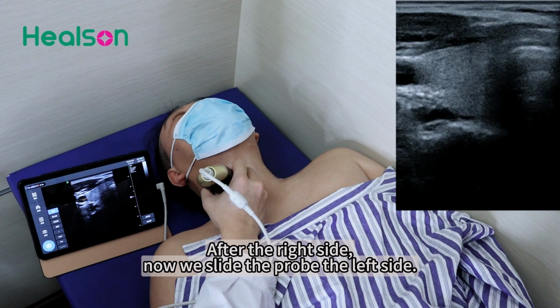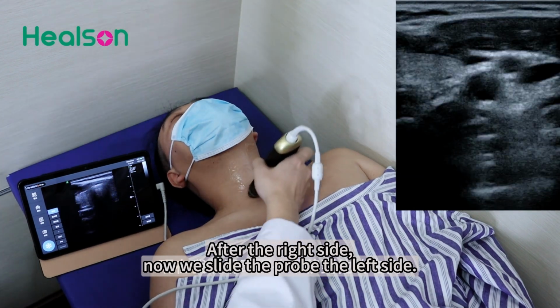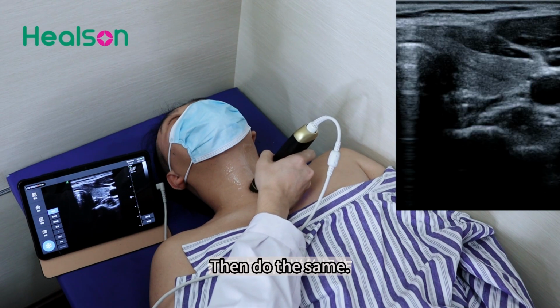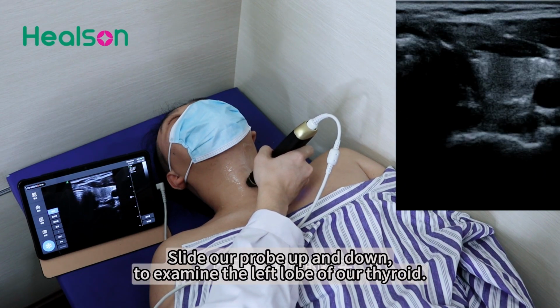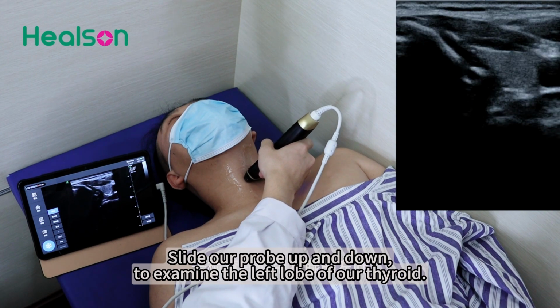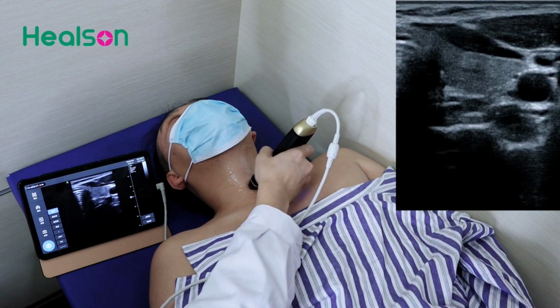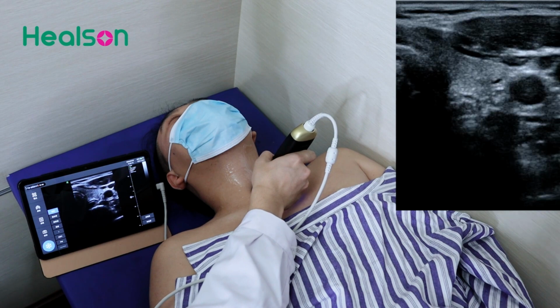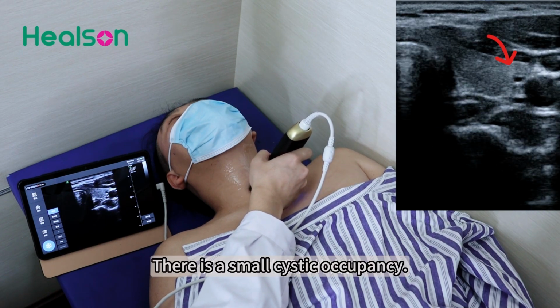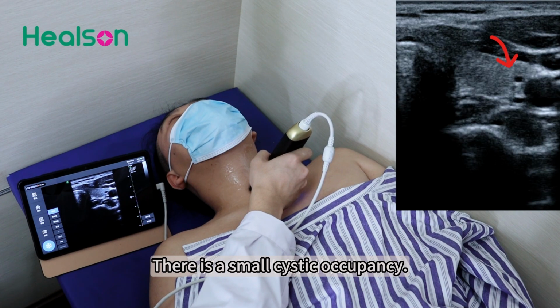After the right side, now we slide the probe to the left side. Then do the same. Slide our probe up and down to examine the left lobe of our thyroid. You can see this area. There is a small cystic occupancy.